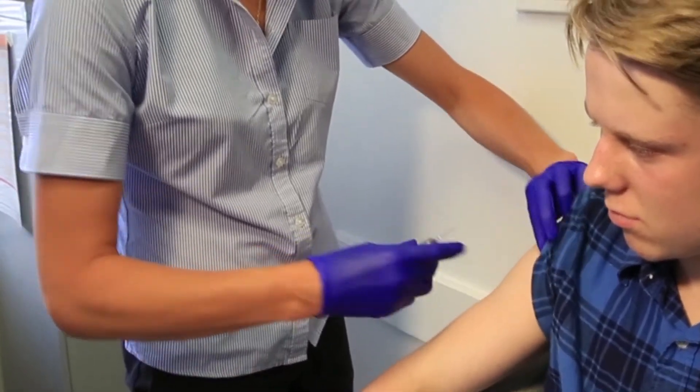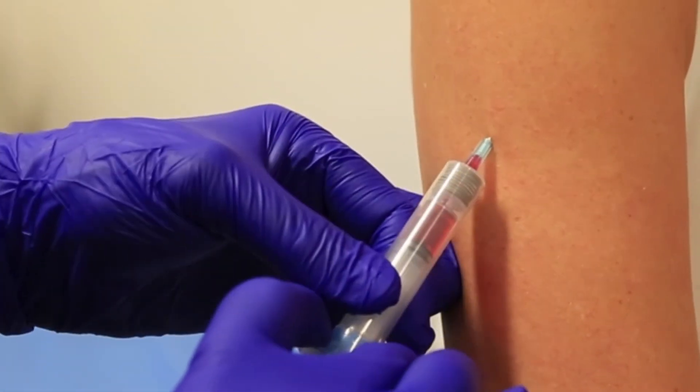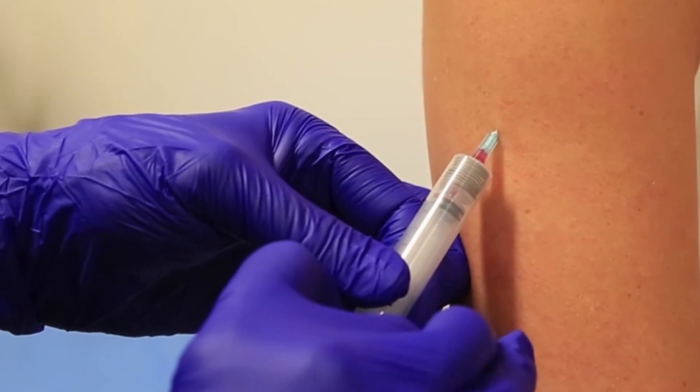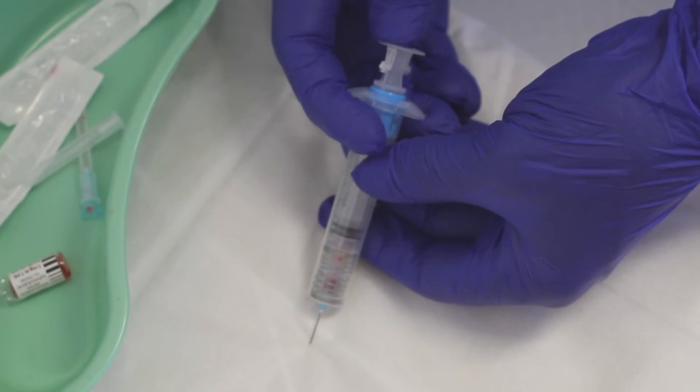The syringe is then put into the patient's arm, the drug is injected, the retraction mechanism comes into play, and as you can see, the rate at which the needle retracts is controlled by the operator's thumb.